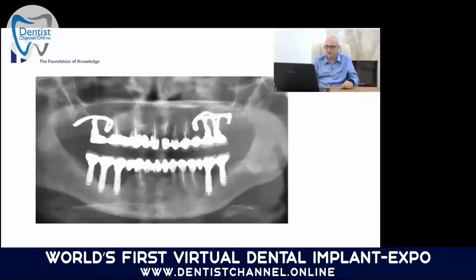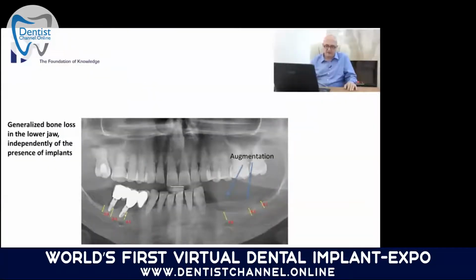This implant looks quite okay. So five implants were placed, and four implants out of five have periimplantitis around them. I would say this is a pretty normal situation, especially because there are still teeth in the mouth. Also, I don't know why the doctor connected the teeth to the implants, but he did it or she did it. And this is a situation like we see it almost every day in our clinics. Also on this slide, you see generalized bone loss on the left side, bone loss on the right side.